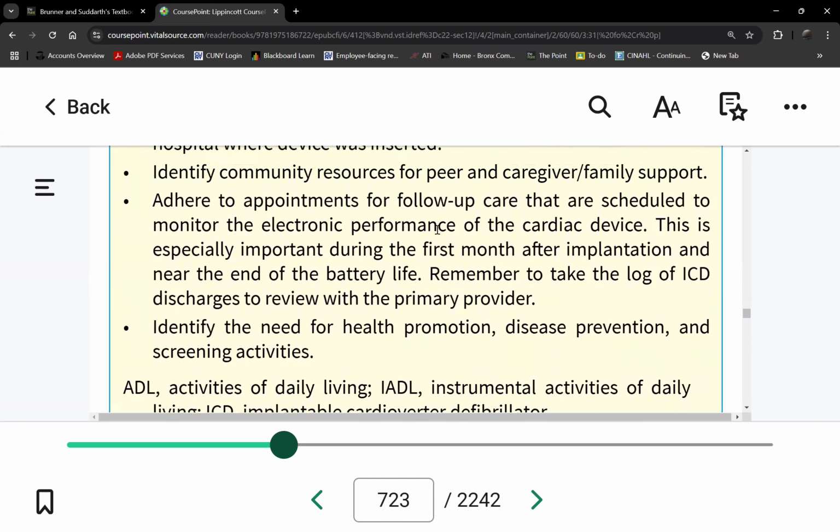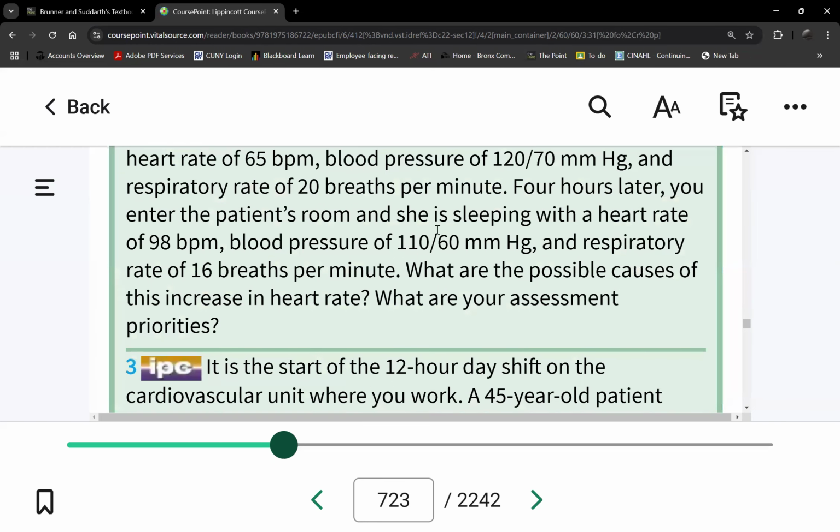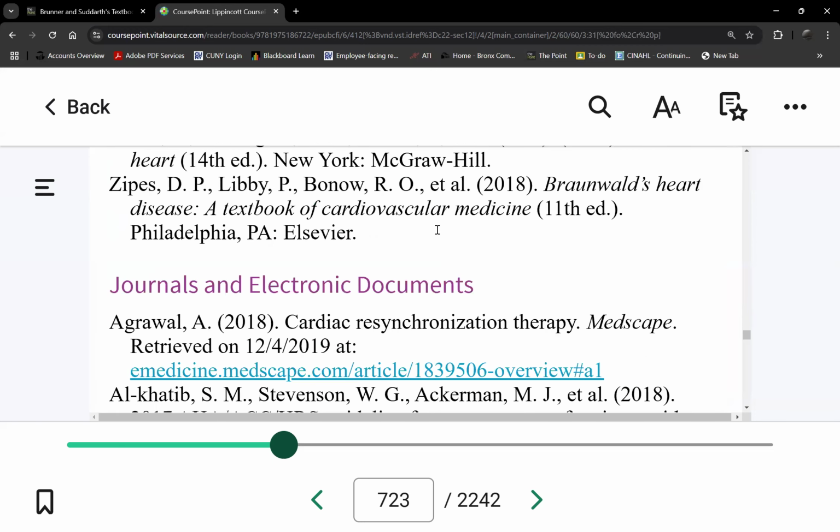What do they do again whenever it does fire? Call 911, or at least drive to the ER. If it fired once, go to the ER. But sometimes it malfunctions, like it won't stop firing. That's a battery. So either way, you call 911.